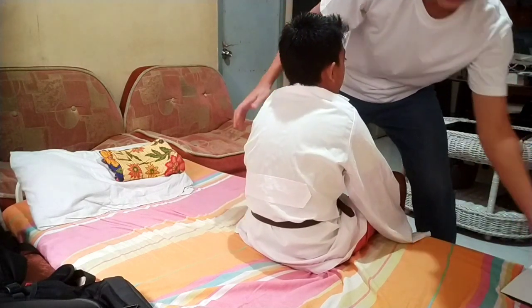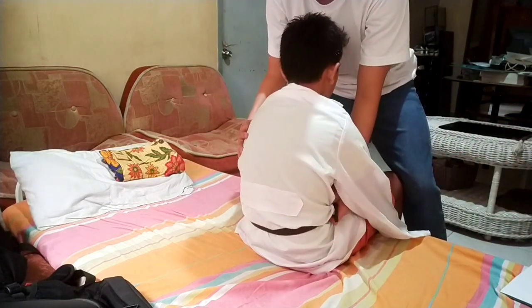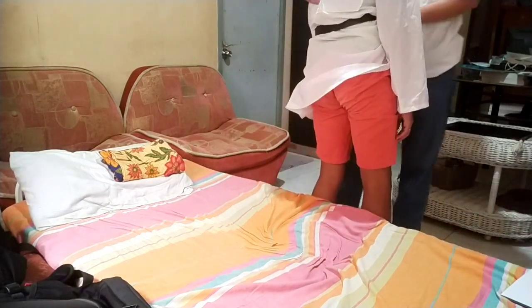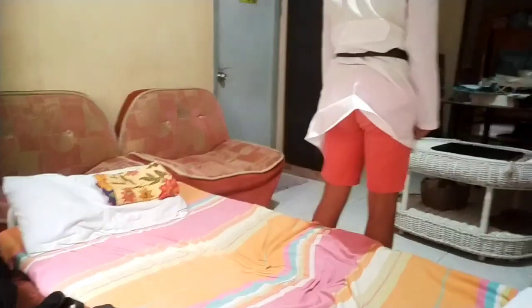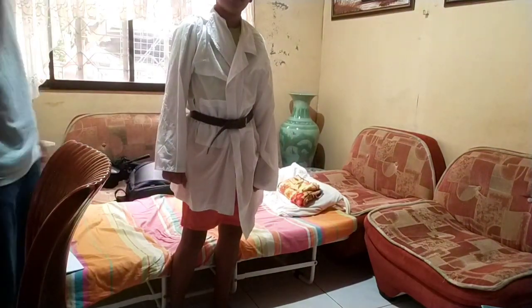So now, sir, assist them to stand. 1, 2, 3, go. Sir, can you do it? So wait, move the camera to a better position. Just like that. Just like that.